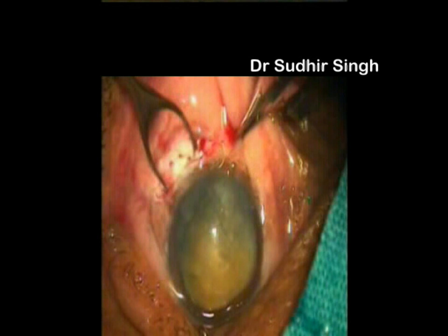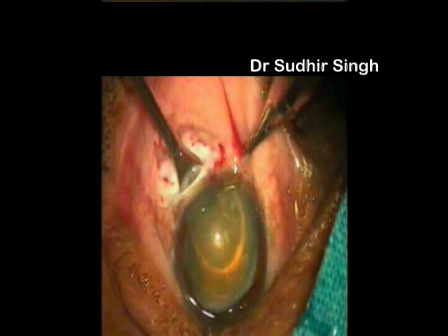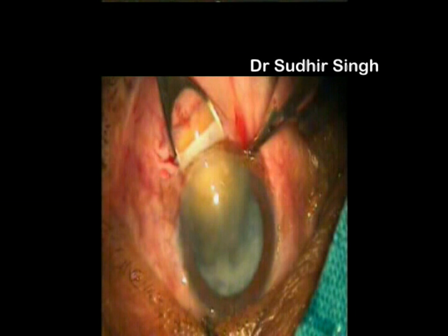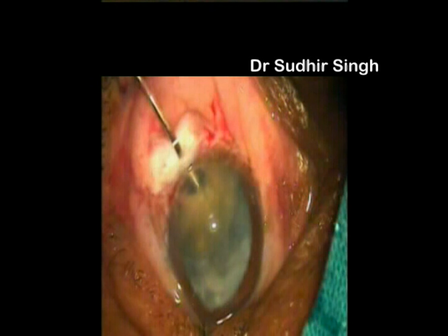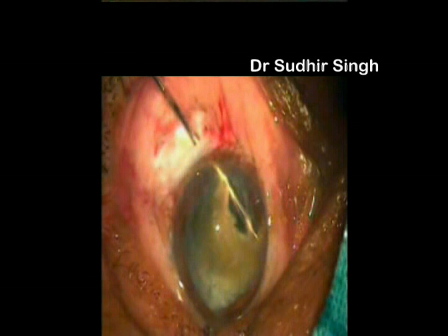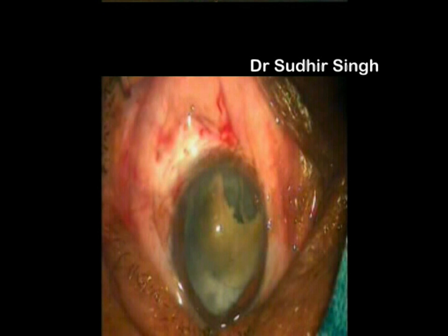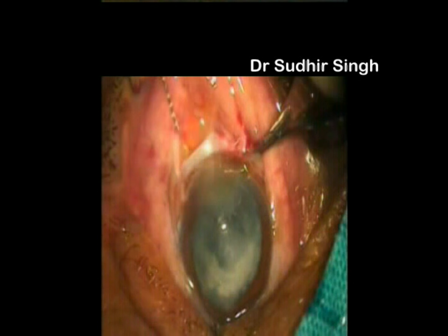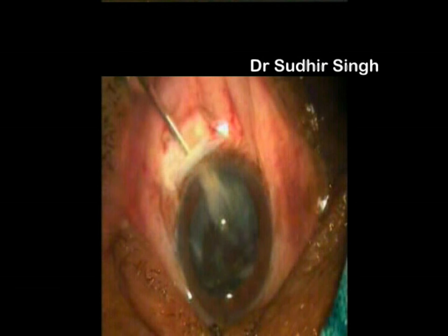The nucleus is engaged in the vectus and slowly withdrawn while the posterior lip of the tunnel is depressed. When the nucleus is engaged in the tunnel, the vectus is pulled posteriorly and upwards. This causes breaking and removal of a part of the nucleus, while the other part remains engaged in the tunnel. The engaged part is pushed back and rotated so its longitudinal axis coincides with the longitudinal axis of the tunnel. The remaining part of the nucleus is then taken out slowly while the posterior lip of the tunnel is depressed.